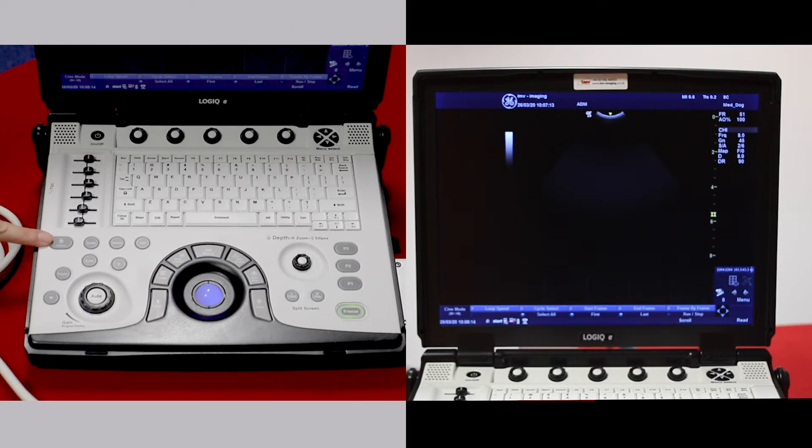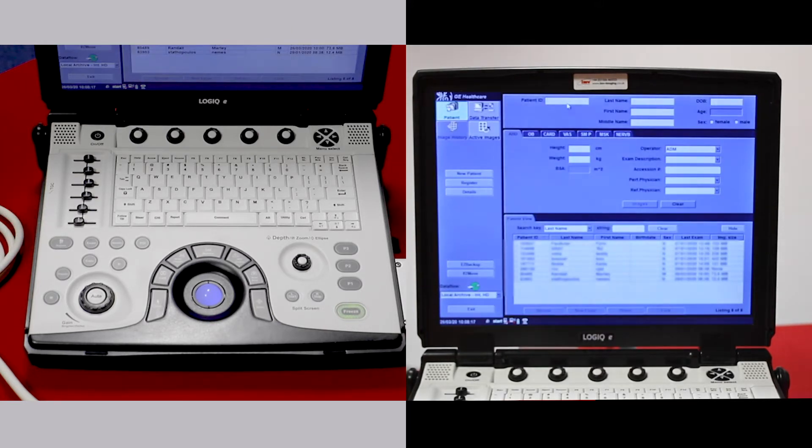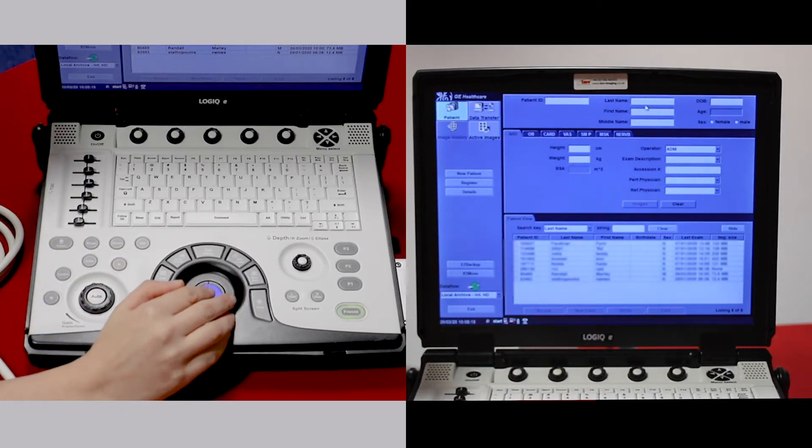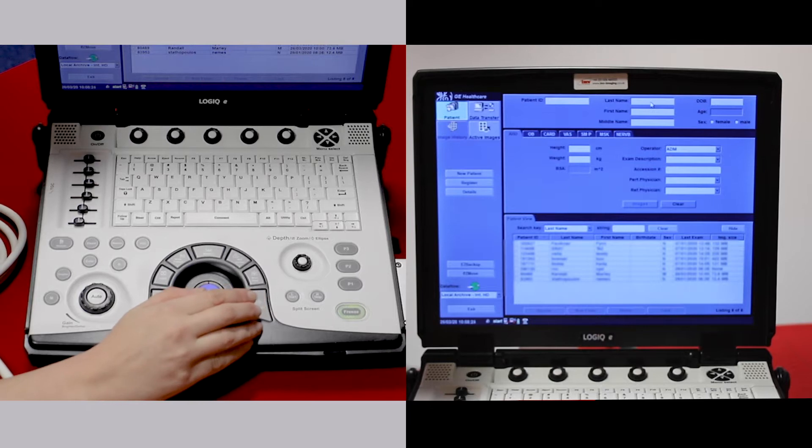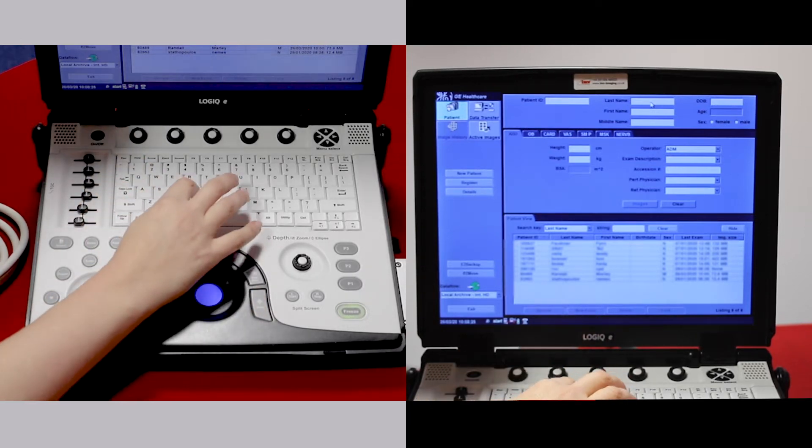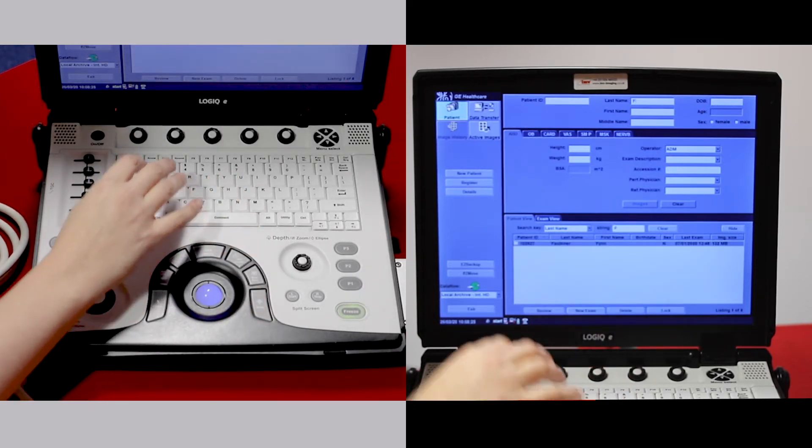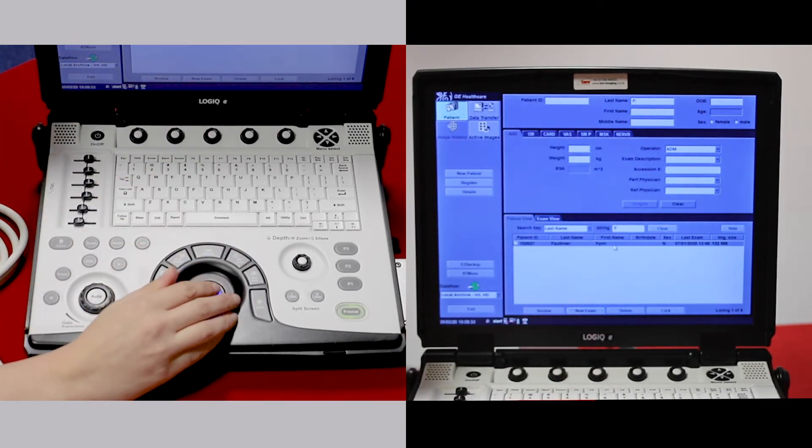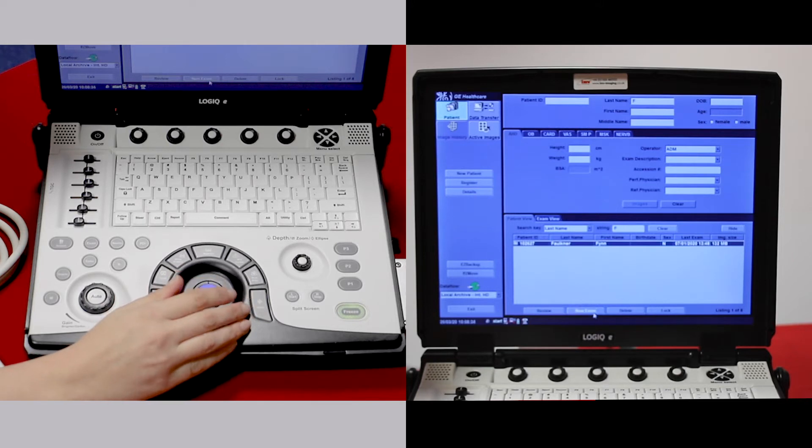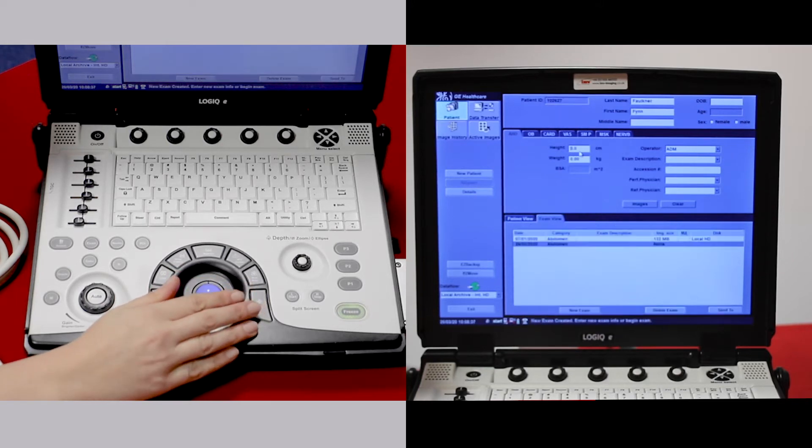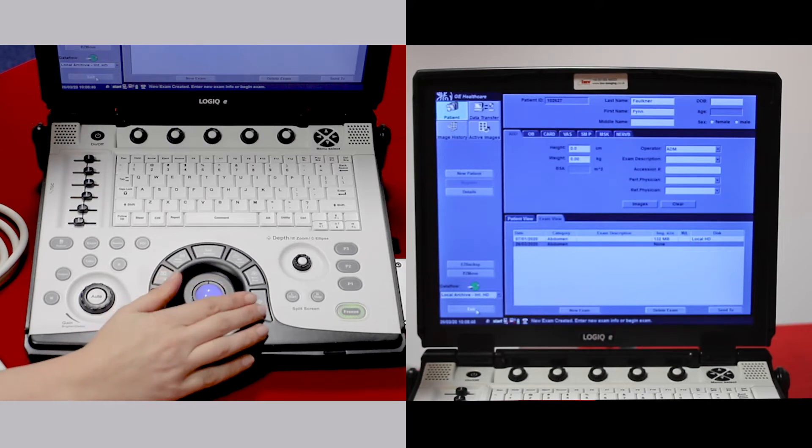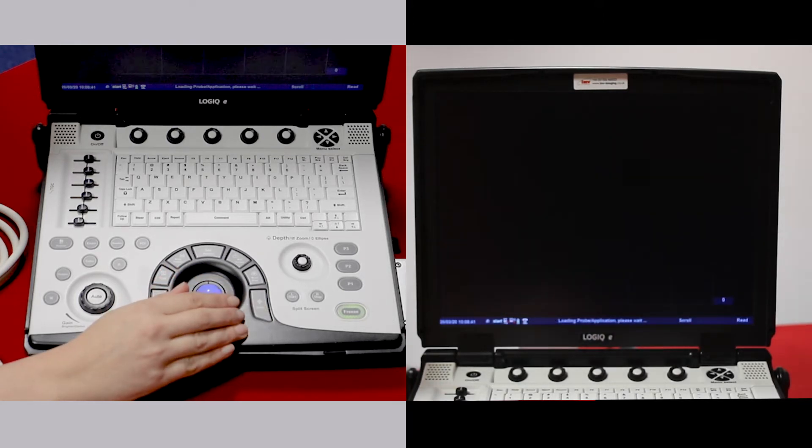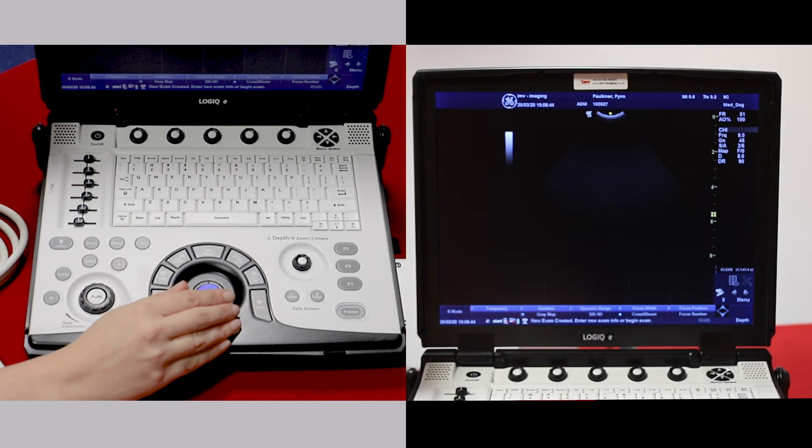Press patient on the left hand side here. If you think you might have scanned this animal before, you can start typing in the name here. If you have, then that animal will be displayed at the bottom. You can click and go into new exam. Then bottom left exit and you'll be creating a new exam for that same patient.